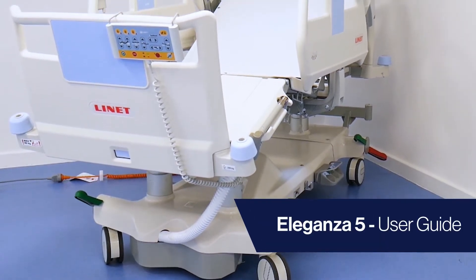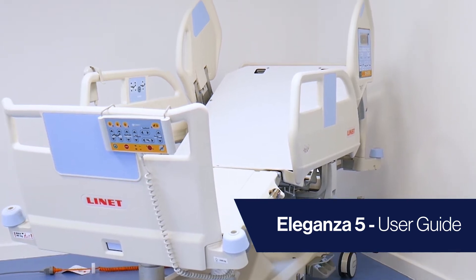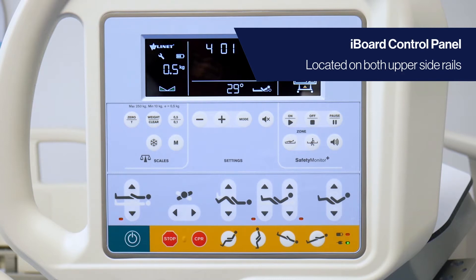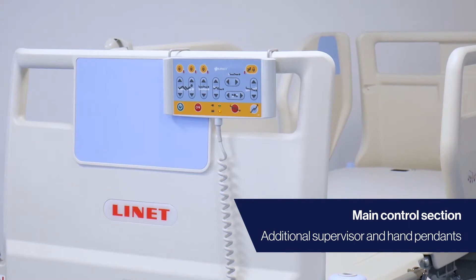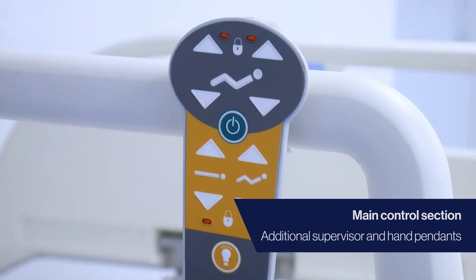In this video, we will cover the Eleganza 5 bed frame and how to easily operate its core functionality. For access to the general functions of the bed, find the iBoard control panel. This is located on both upper side rails at the patient's head end. This is the main control section, which is also supported by an additional supervisor pendant and hand pendant.